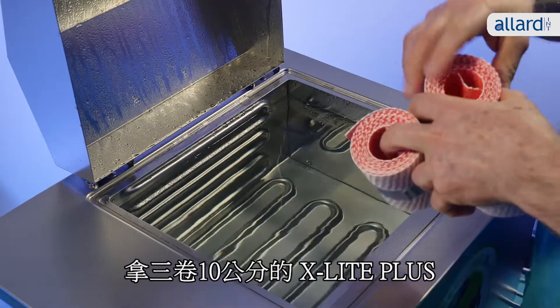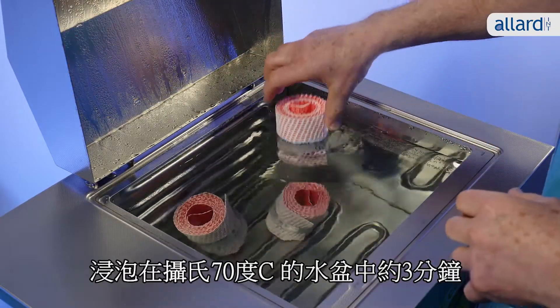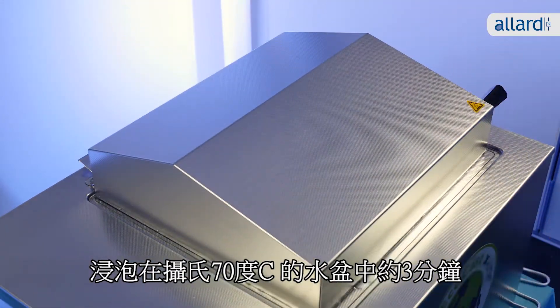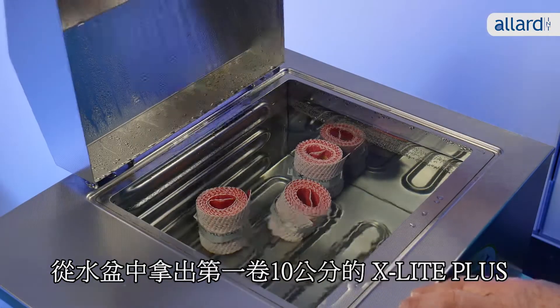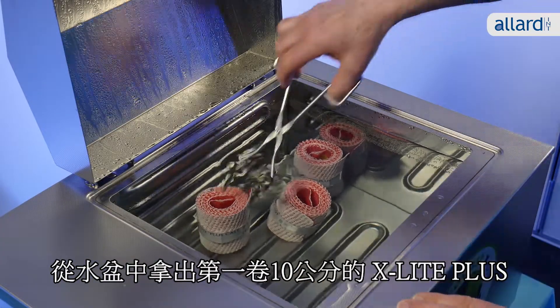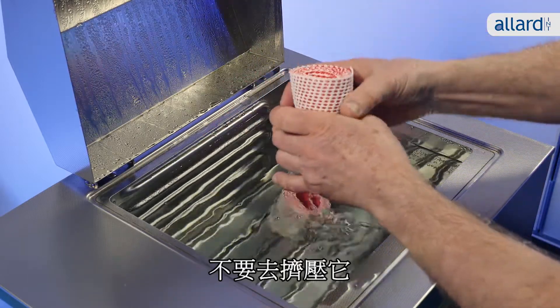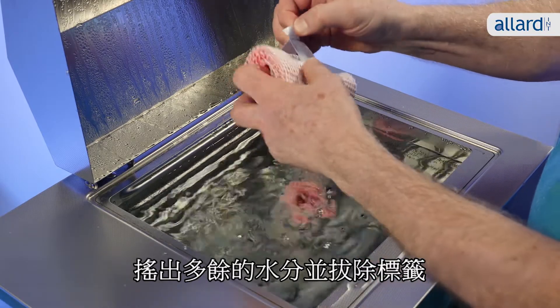Take three rolls of 10cm X-Lite Plus and immerse them in the water bath for approximately three minutes in warm water at a temperature of 70 degrees Celsius. Remove the first 10cm X-Lite Plus gently from the water bath. Make sure not to squeeze the roll. Shake off excess water and remove the label.